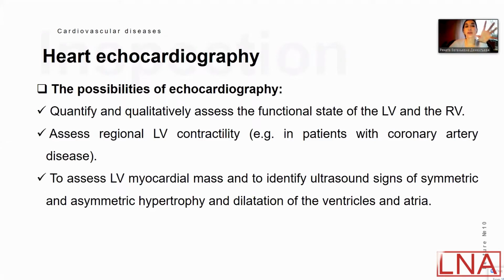So if you look at the purpose and the changes which we can determine during echocardiography, you can understand that it's multidisciplinary, and it's one of the most important methods of diagnosis of the cardiovascular system, one of the important non-invasive methods of diagnostics. It's routine, it's really not very hard to put the source of ultrasound on the projection of the heart and assess all these points.